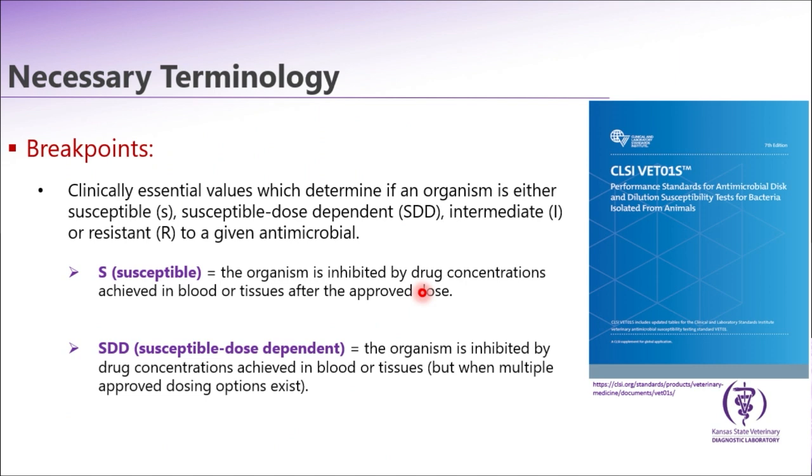And then comes this important point about the breakpoints, right? This is the important question that we always get in the lab. What are these breakpoints? Why are they important? And how do they play a role in the interpretation or determination of the bacterial organism's susceptibility?